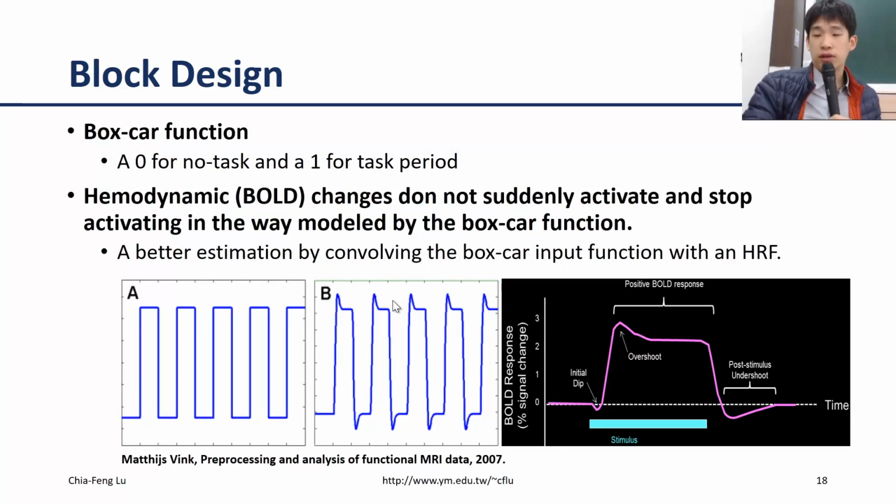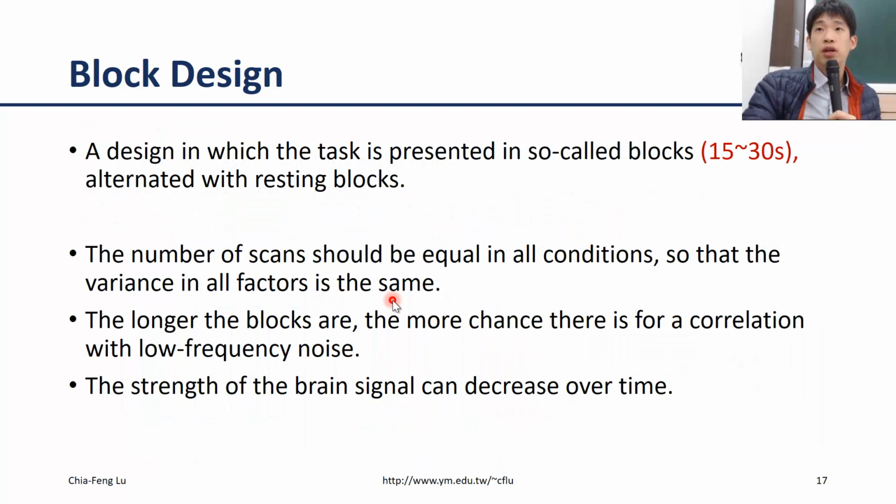When you say 20 seconds, does one grasp take 20 seconds? No, the block. Within a block, you can ask the subject to do the grasp at maybe a 1 second frequency, just do the hand grasping, and it repeats for 20 seconds. So if there is a 1 second frequency, then it's 20 graspings within a block.